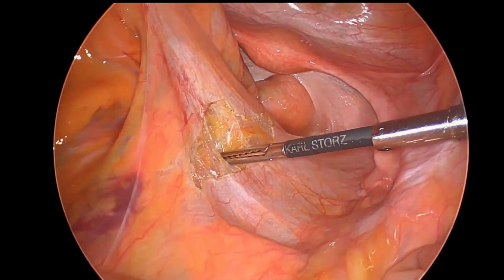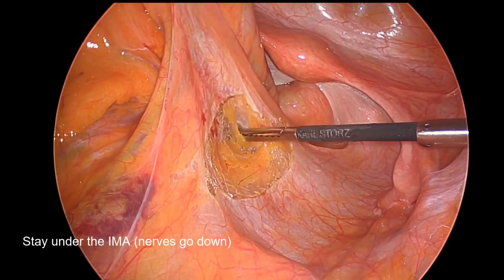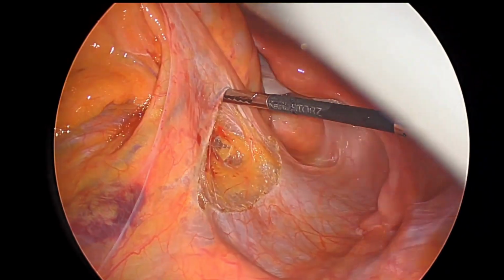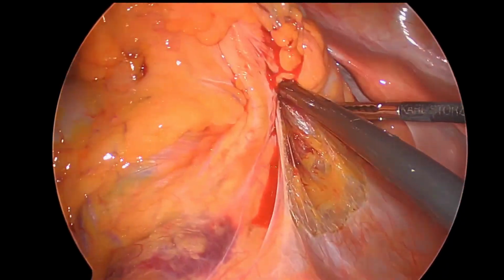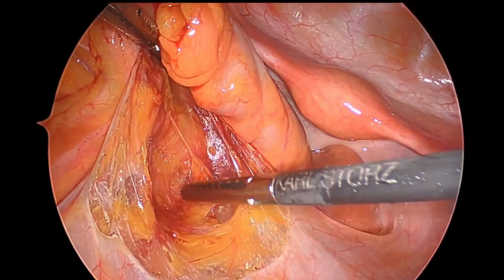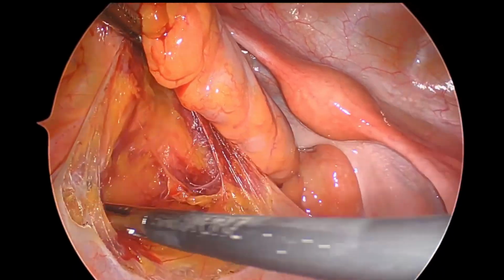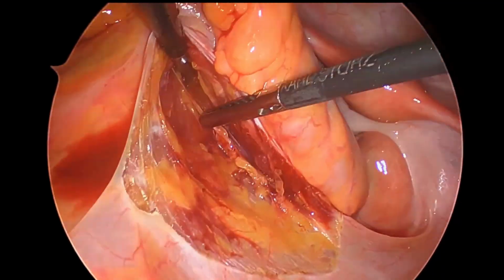Obviously, this is a very thin patient, and you could actually see the left ureter vermiculating there in an earlier shot. You want to keep your friends close and your enemies closer, the enemy being the IMA here. You want to stay right under the IMA pedicle. All the nerves go down. And a really important key component to doing this dissection laparoscopically is to really give strong tension with your left hand, the hand that is not doing the retraction, up towards screen left.